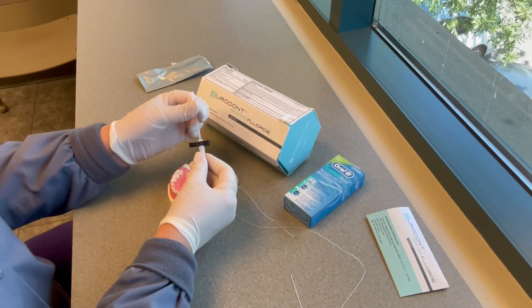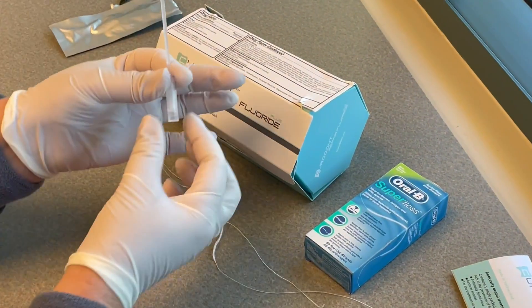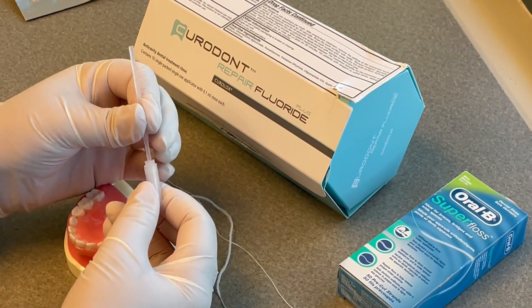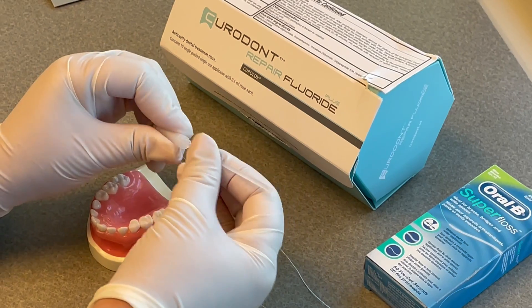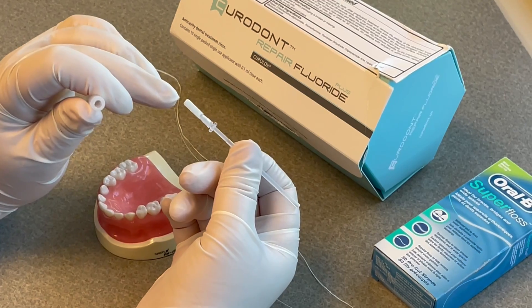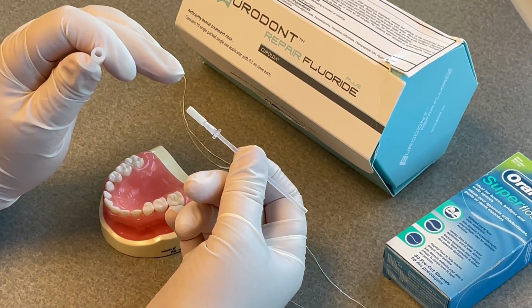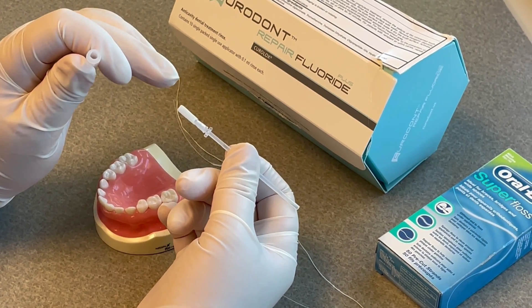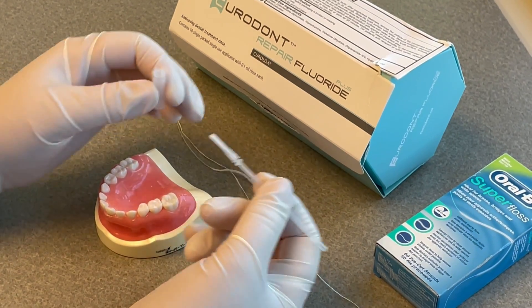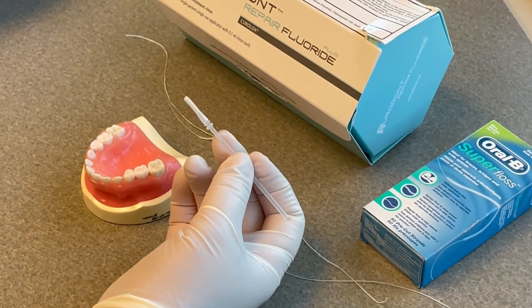When you get it out of the package and remove the little protective barrier, you push the little sponge down into the liquid to get the sponge moistened. The sponge has the active ingredient that has to contact the surface you're treating. So you can't just put a microbrush in here and brush it on the tooth — that's not going to work. You can't put it on super floss either — that's not going to work. The sponge actually has to contact the surface.